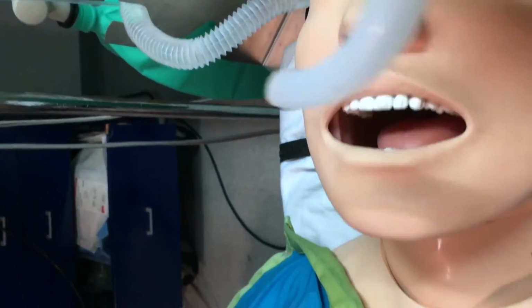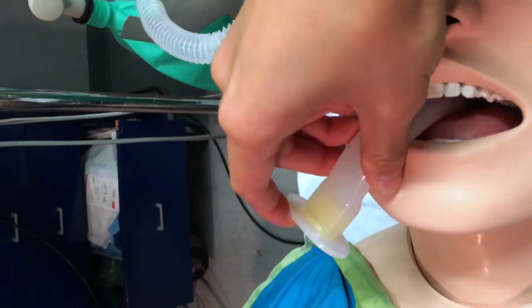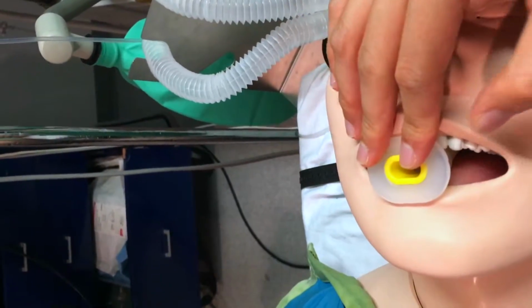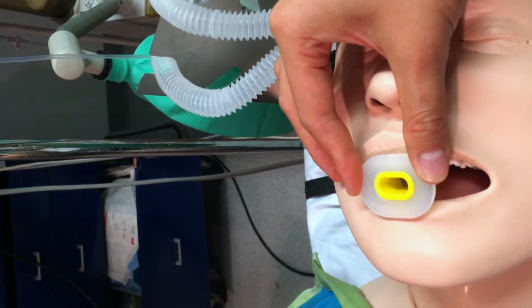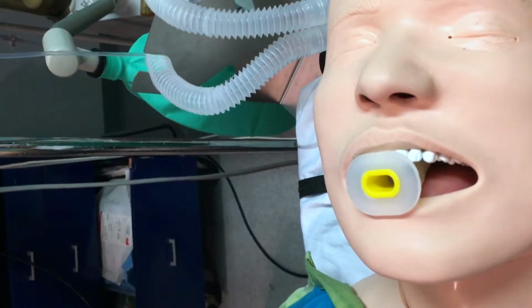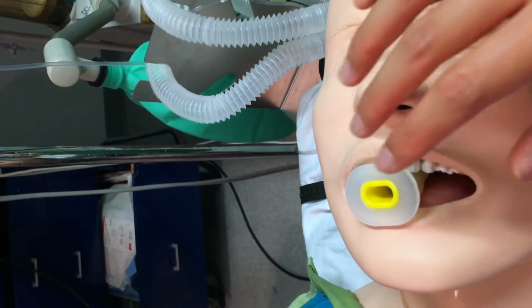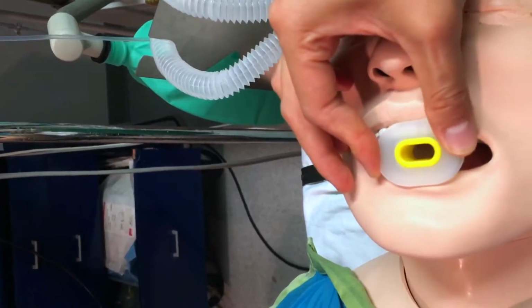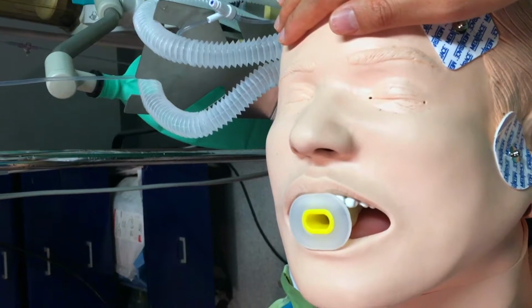So when we put it in, you want to insert it on the side and then gradually shift it into the right position, and it should just fit like this. The flange should be resting against the lips, and the tongue would normally be kept in the forward position. Thankfully with a mannequin it is, but this is when a tongue blade would be helpful. And you want to avoid soft tissue and dental pressure or injury when you place this in. But now the patient has a better way to breathe. There you go.